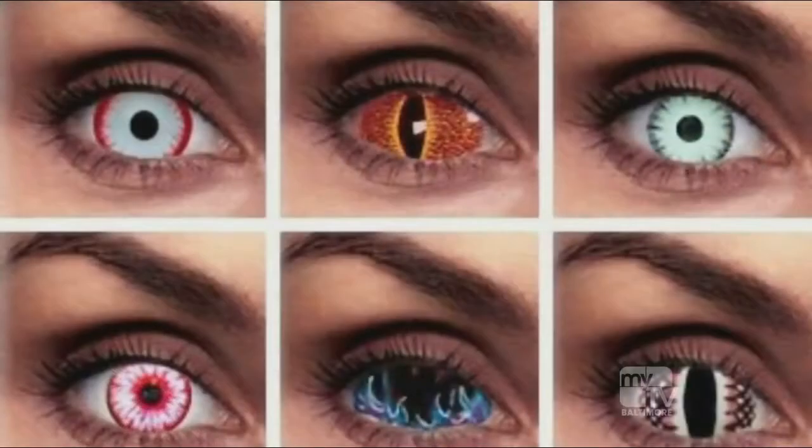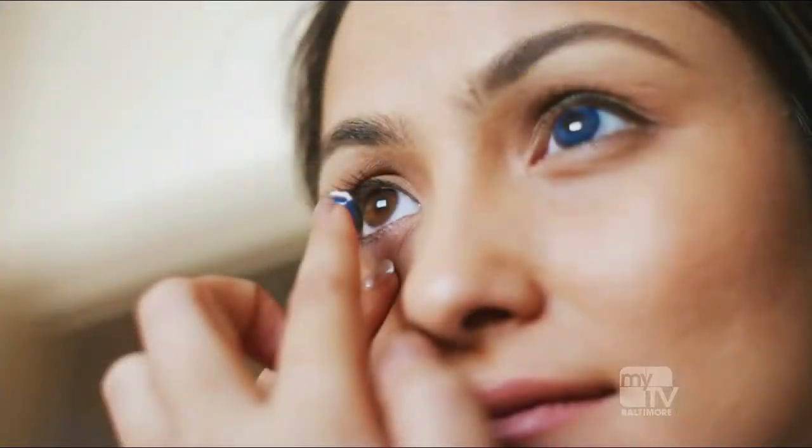Correct. Yeah, especially this time of year with these pop-up Halloween costume stores, party stores, even online, any time of year. You can order these lenses that are not regulated in terms of the material that you're using, how they're being stored, expiration and all that. But it really comes down to the fitting as to the main danger for the contacts. Oh, that's interesting. So what are some of the things that can go wrong if we do decide to wear these?